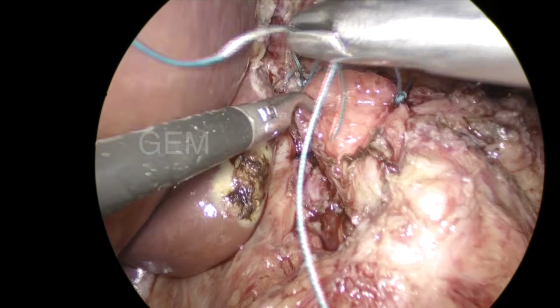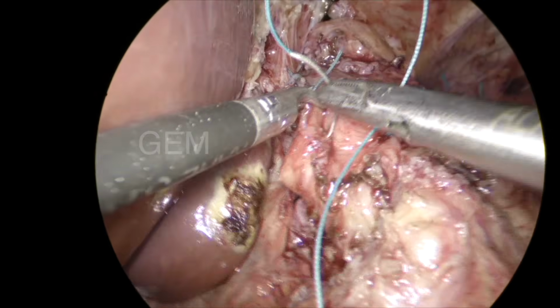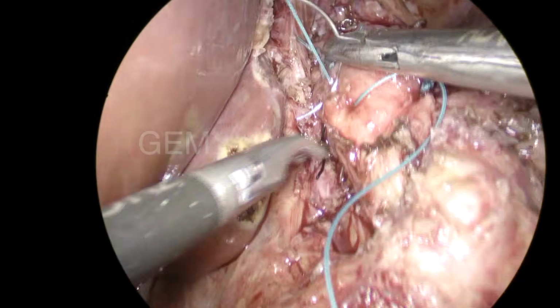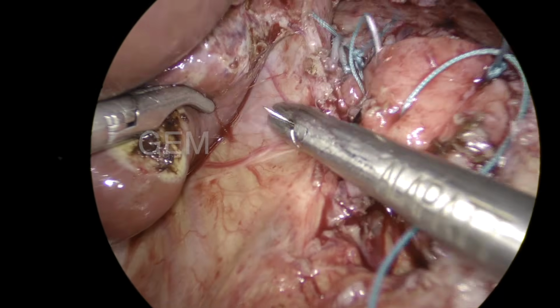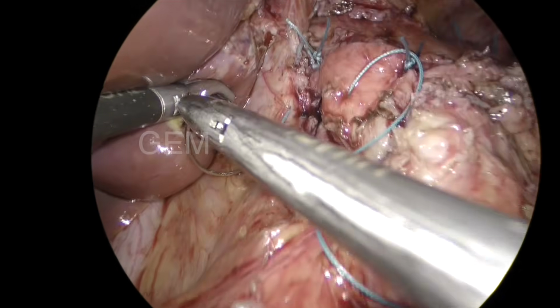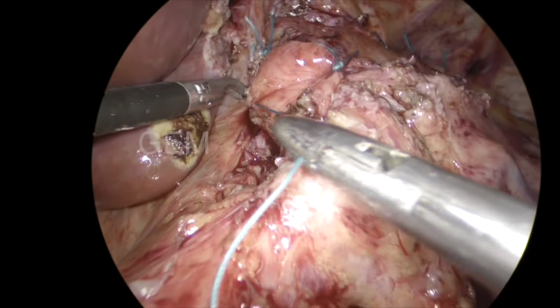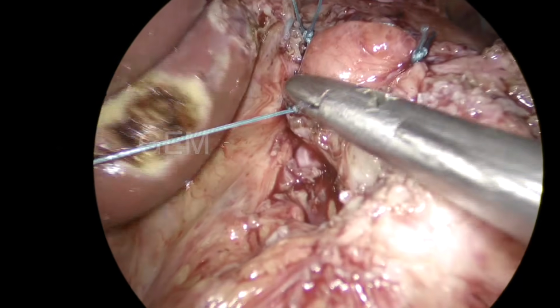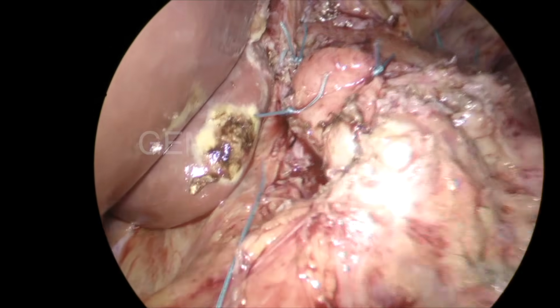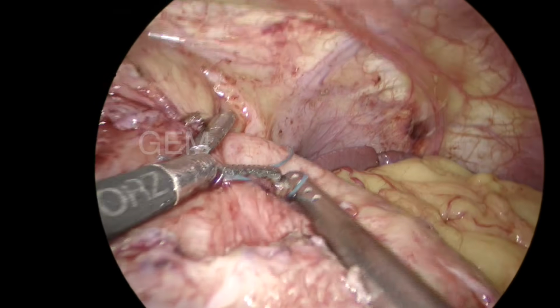So 3 sutures are made on both sides, and this is the suture for fixation of the wrap to the right crus. You can see I am taking a good thickness of the right crus to prevent transmigration of the wrap into the hiatus. The hiatus is already narrowed and doesn't look loose. The lie of the esophagus and stomach is good.